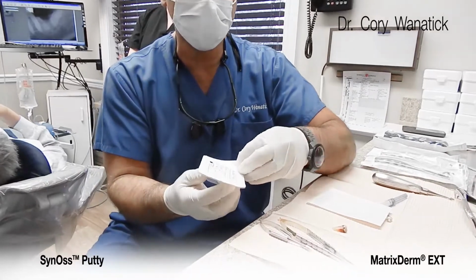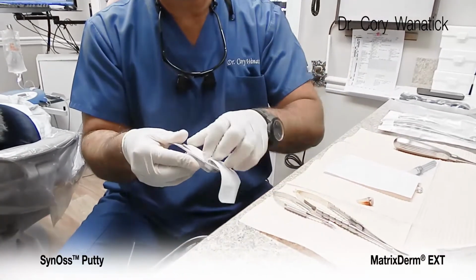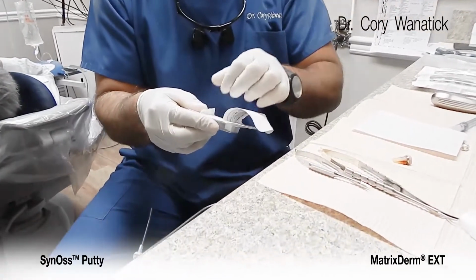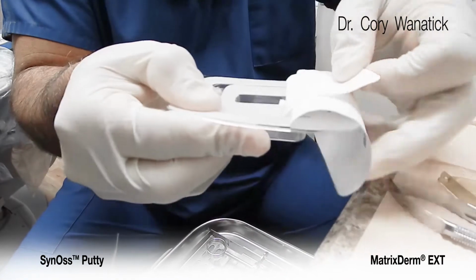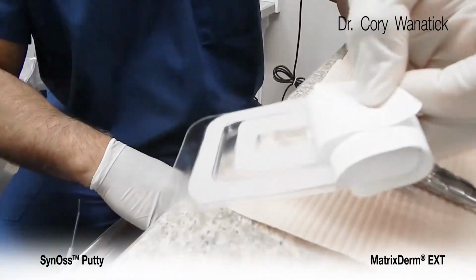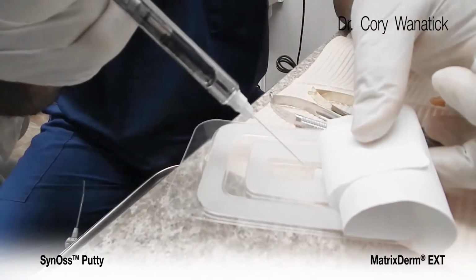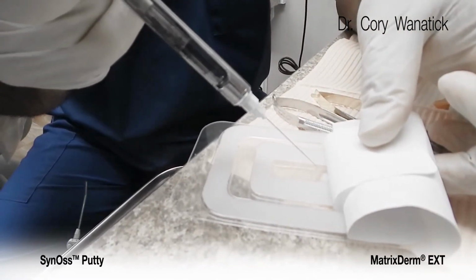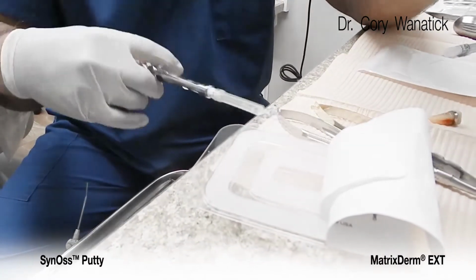Okay, we're opening up the Synos putty, 1cc. Opening up the putty, you can see it. What I'd like to do is hydrate with a little local anesthetic. You can use saline or local anesthetic. And we let it sit for at least 1 minute.